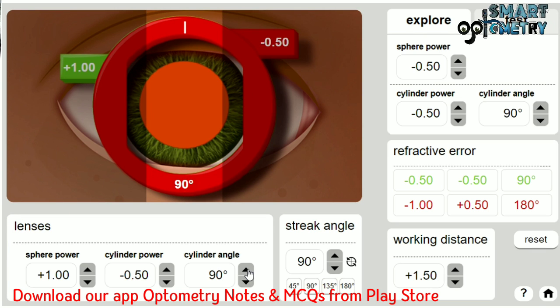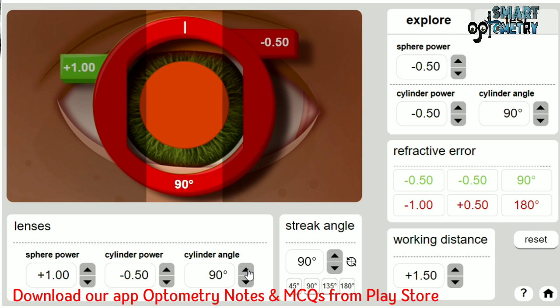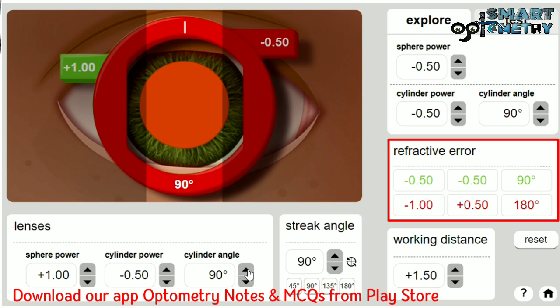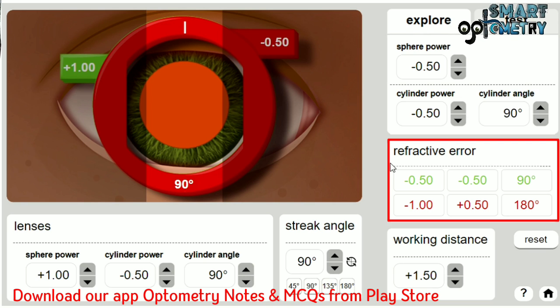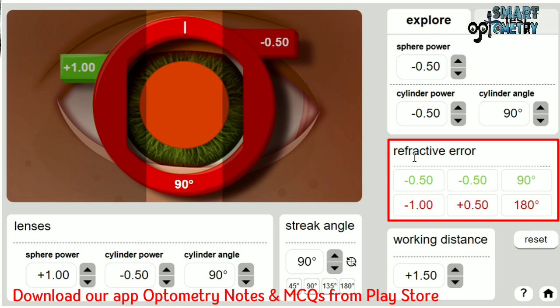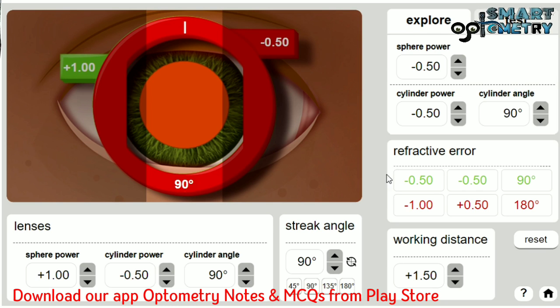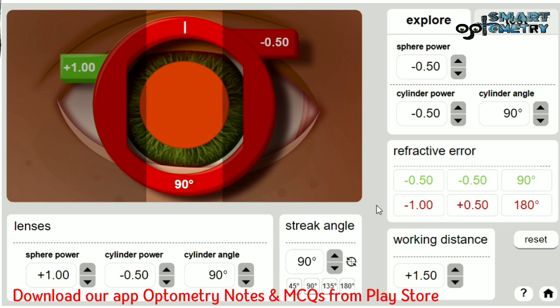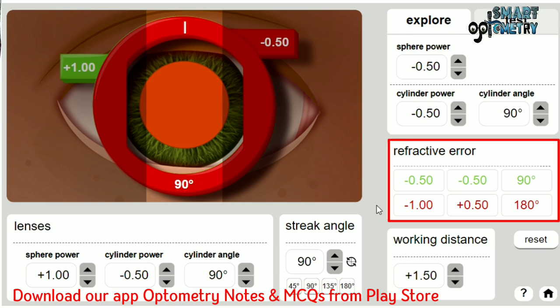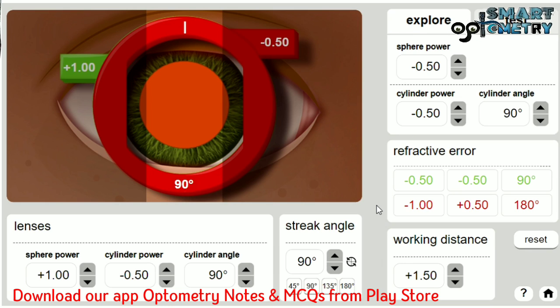Here you can change the axis or angle of the cylinder trial lenses. The patient's refractive error will be displayed in both plus cylinder form and minus cylinder form, so that you can compare your result with the actual patient refractive error and get an idea whether you have done it right or wrong.